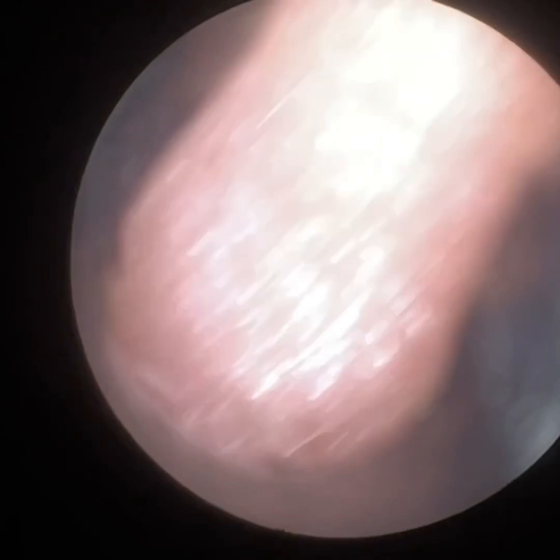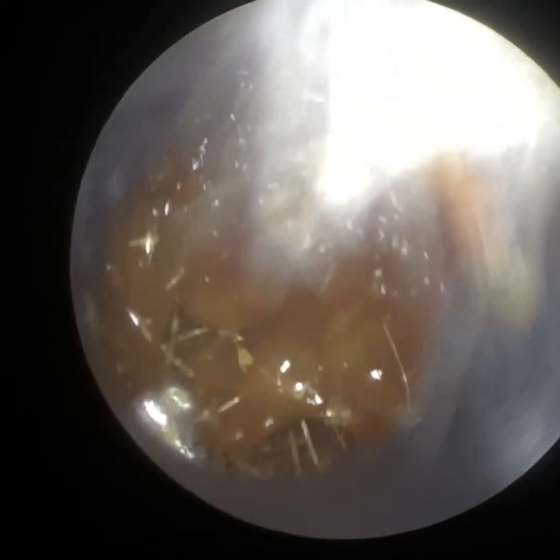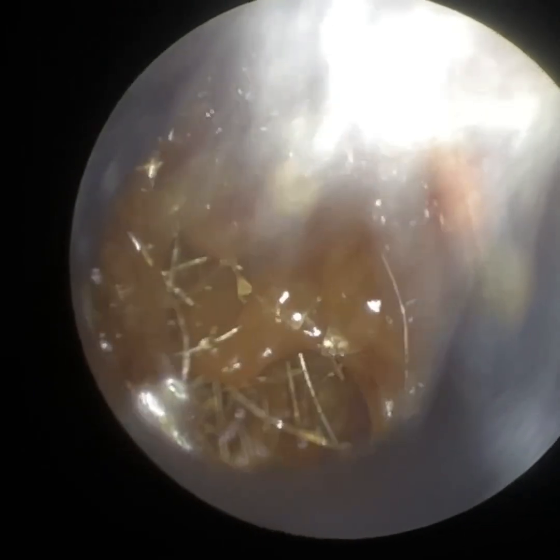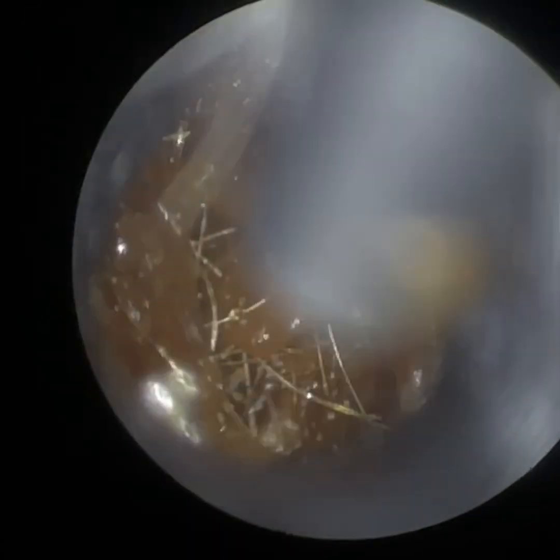We've got four different specular sizes. This is the 4.25mm — the one I'm probably using the most. We've got the core of the occlusion out. We can see there's still quite a bit of wax, and this is right up against the eardrum, so at this stage we're going to have to use the sucker.